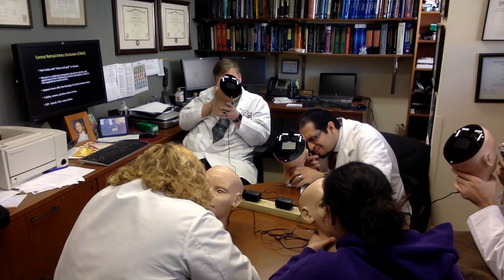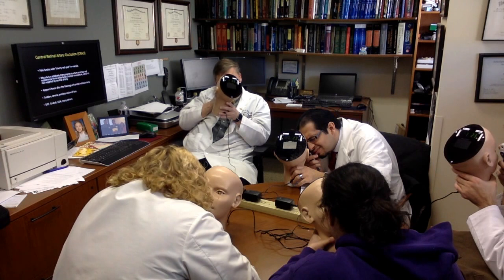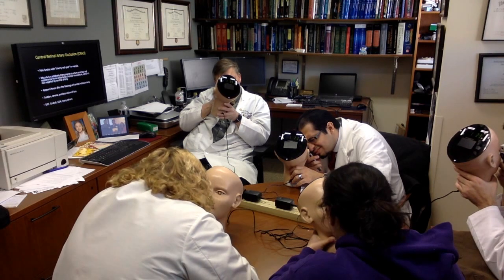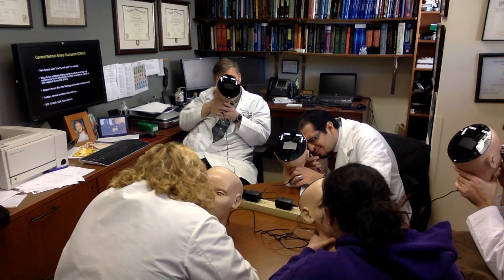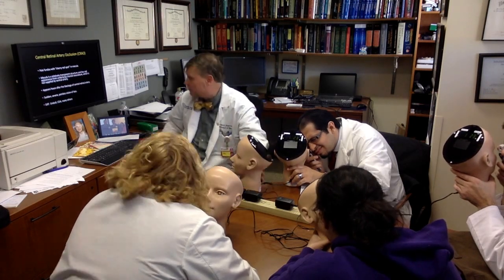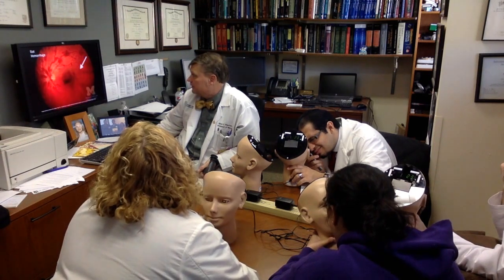Yes. What do you think about the color of the disc? It's a little pale. But then it's surrounded by, oh my God, hemorrhage, right? These are multiple retinal hemorrhages. Okay, multiple retinal hemorrhages. So, let's go back and talk about this.